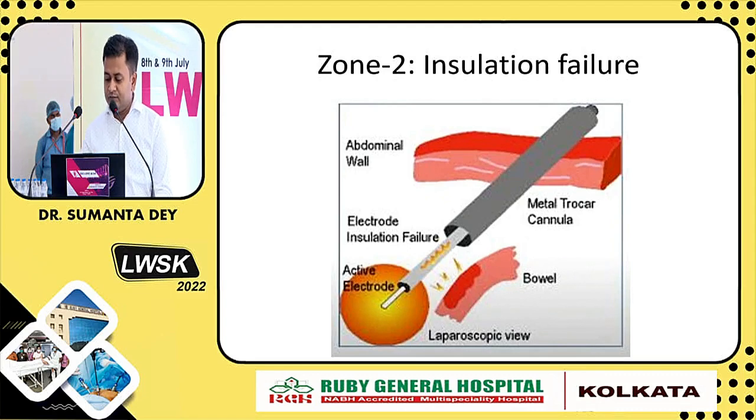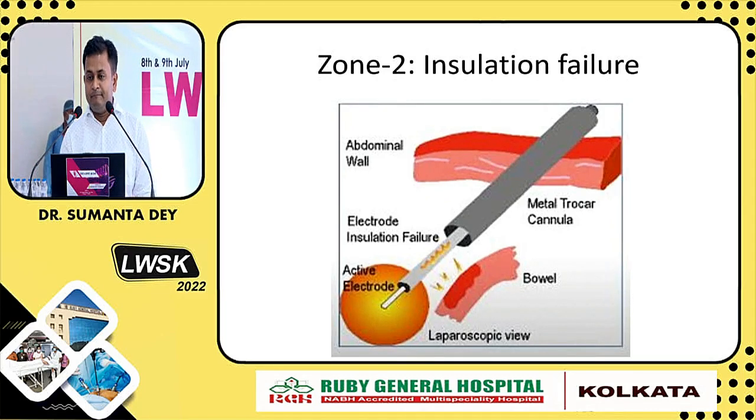There are 2 different mechanisms of zone 2 injury. Zone 2 injury means the insulation sheath that is covering your instrument should be intact. There should be no breach in the insulation. So you have to regularly monitor your instrument while washing it, whether you are washing or your scrub nurse is washing the instruments after the procedure. You have to use at least one magnifying glass and check whether there is any breach in the insulation.